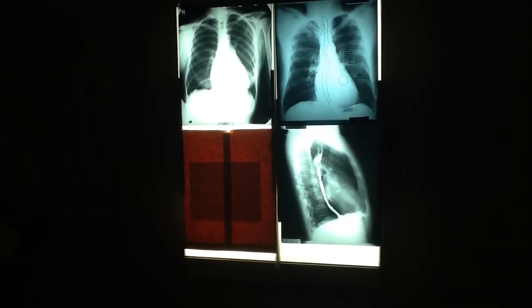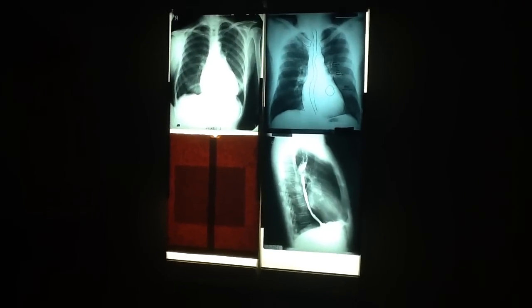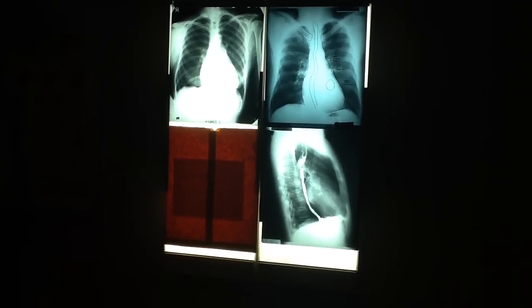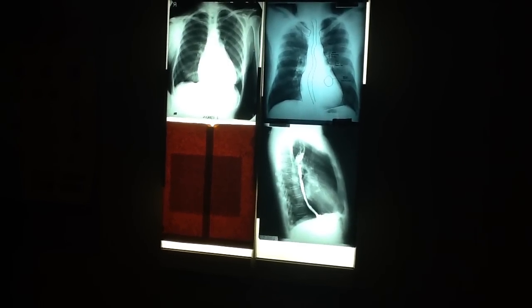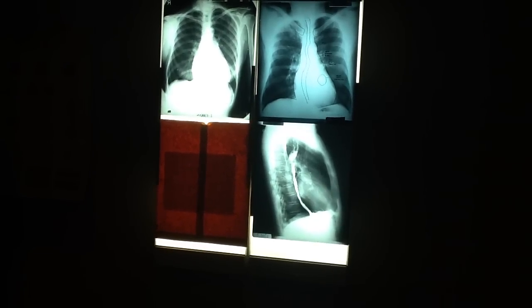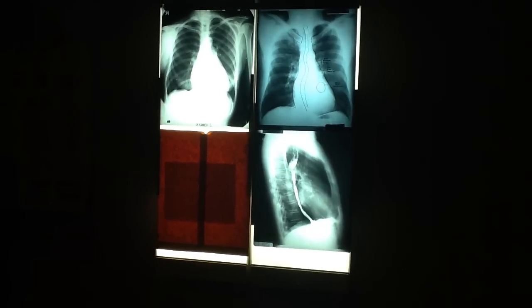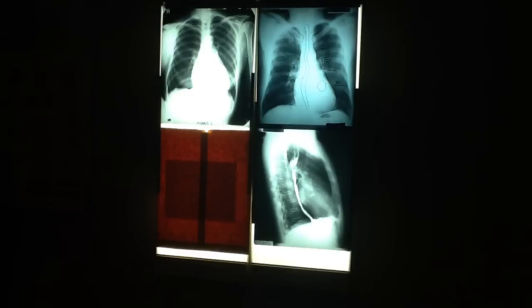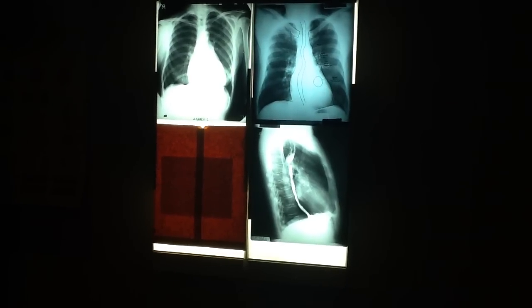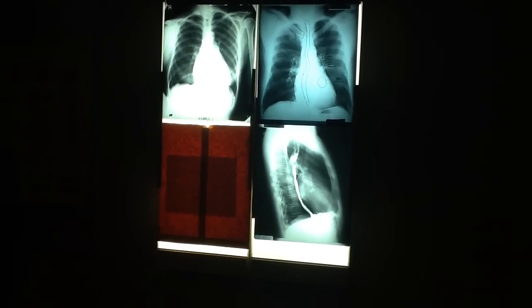And so it's the reason that we focus on which chamber makes up which border of the cardiac silhouette. You know, which chambers are making up that border. That's why we did that little saying, you know, right is right, front is right, left is left, back is left. Rights are singles, lefts are both. It's so that we remember where the chambers are.